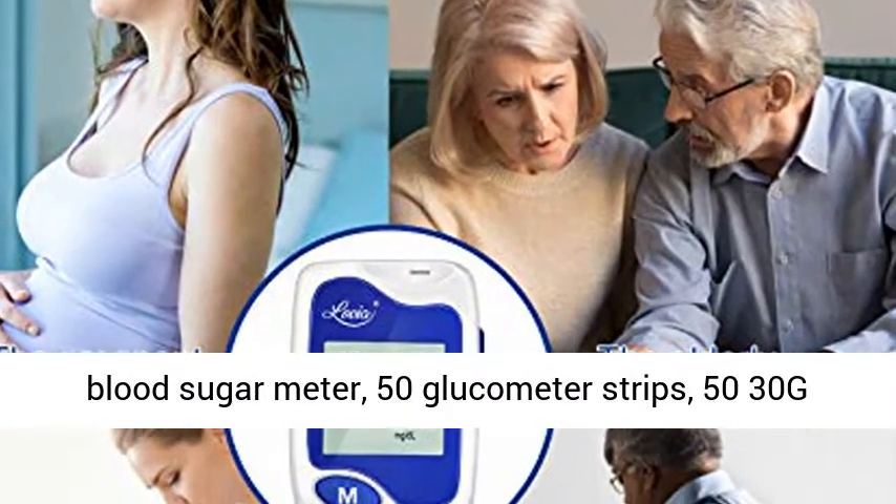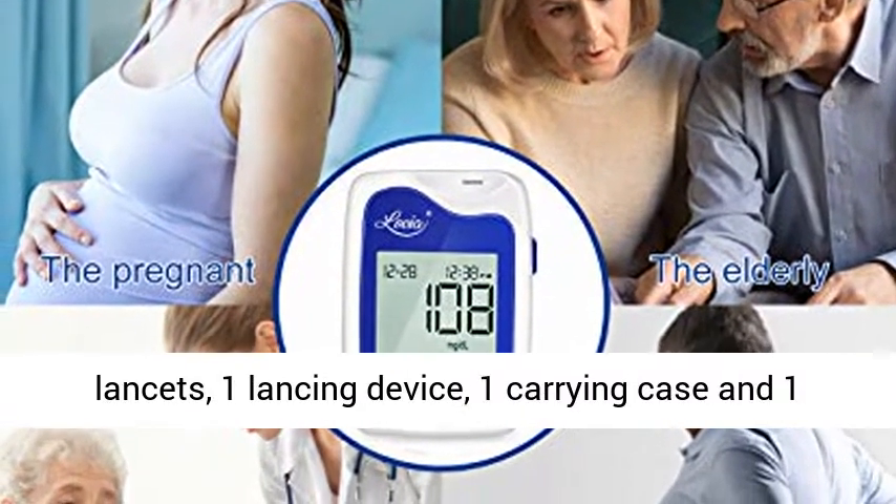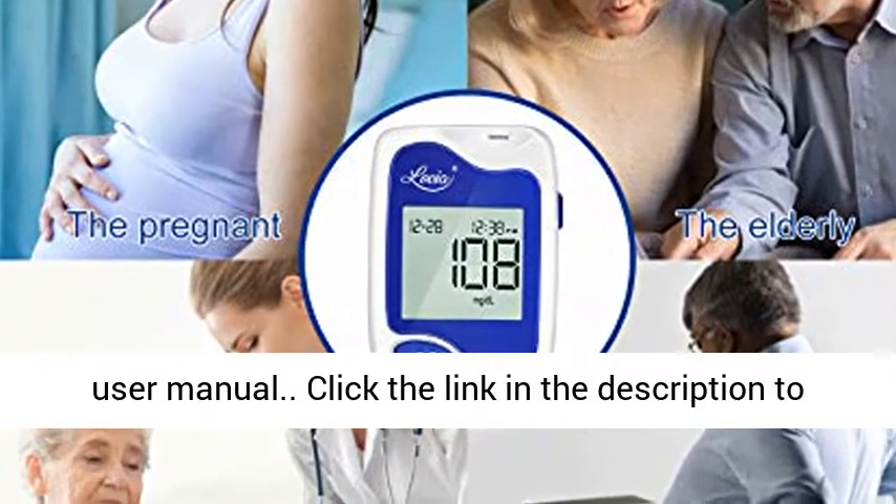What you get: one blood sugar meter, 50 glucometer strips, 50 30g lancets, one lancing device, one carrying case, and one user manual.